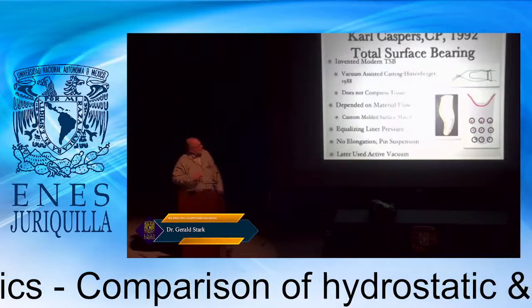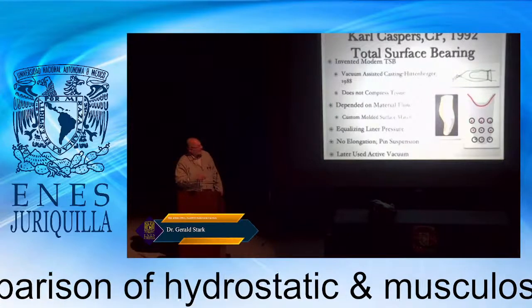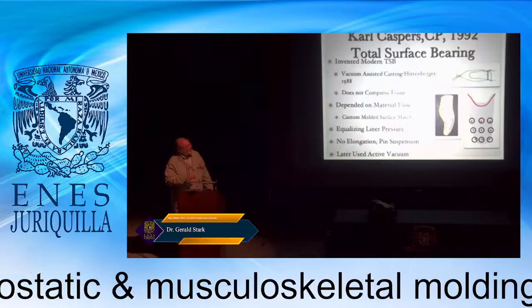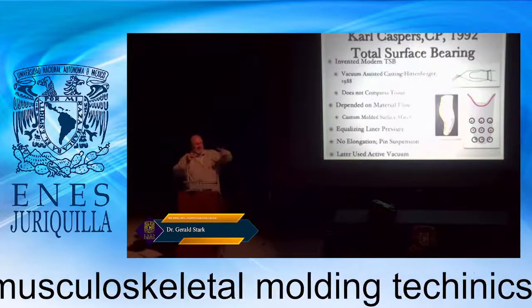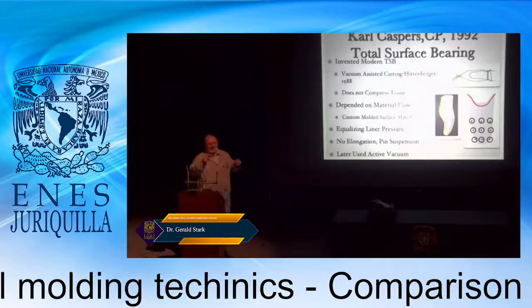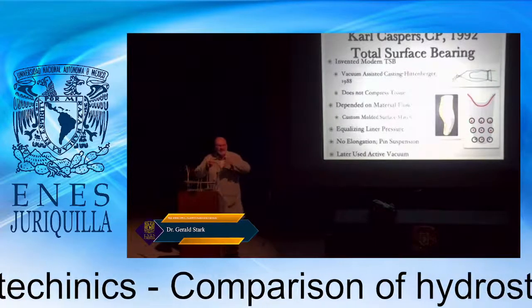He used total surface bearing, but he applied a vacuum to a plastic bladder. The one issue, though, in terms of engineering, is it really didn't load the hydraulic limb, but really just compressed the pressurization of the skin and just held the plaster very tightly. But it didn't really pressurize the limb itself. And that's what's confusing as an engineer. You actually have to compress human tissue.